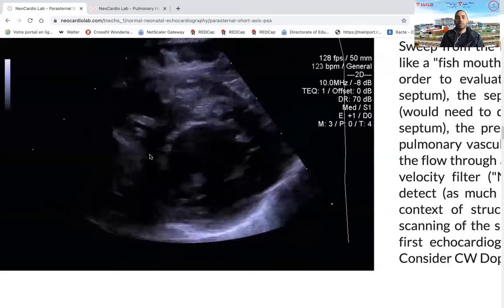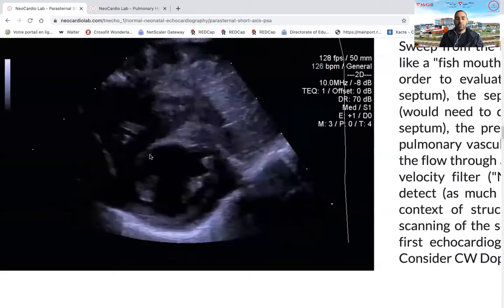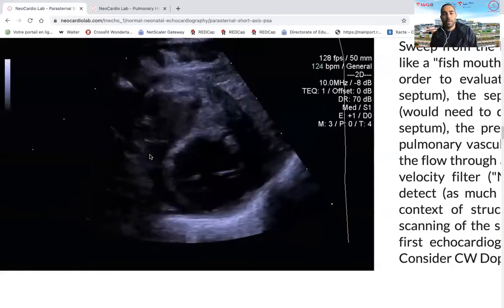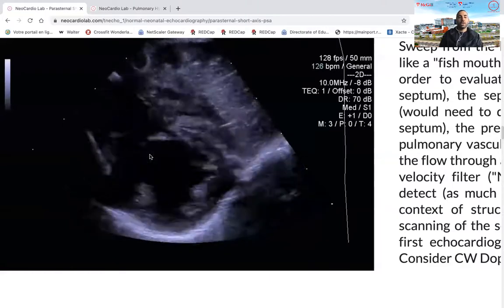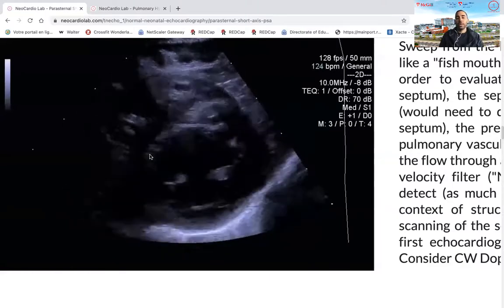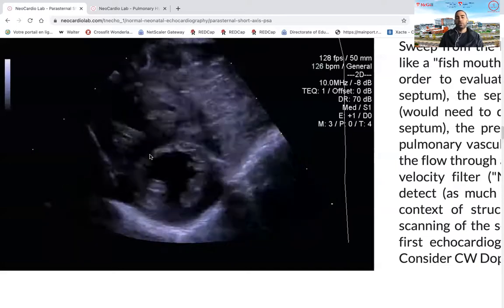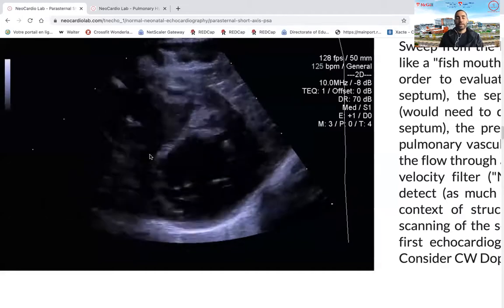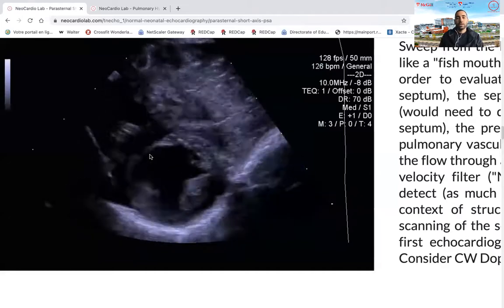And this is obviously true. The assumption that the septal wall gives you information about the afterload pressures is true if you have normal configuration of your RV outflow tract, if you don't have stenosis, and also if you don't have a massive VSD that will cause equalization of pressure during the cardiac cycle between the two sides of the septal wall.